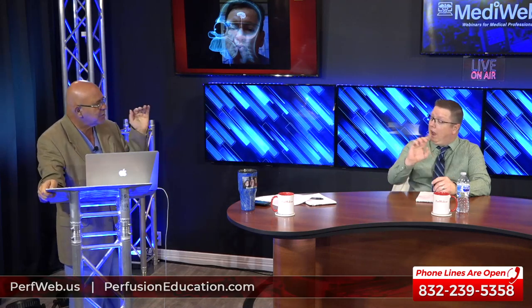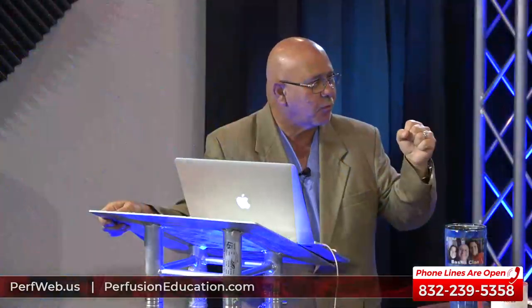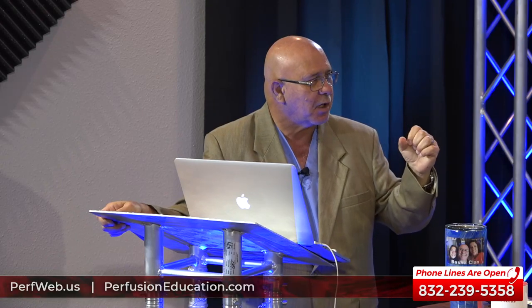The pressure at the end of the line, the outflow, is reduced. How does it behave? You're not having a nice streamlined linear flow. When you clamp it acutely, it just stops, and you feel that pressure drop.